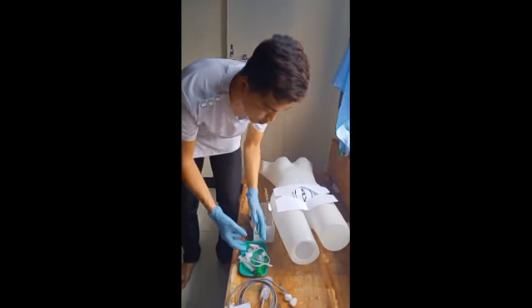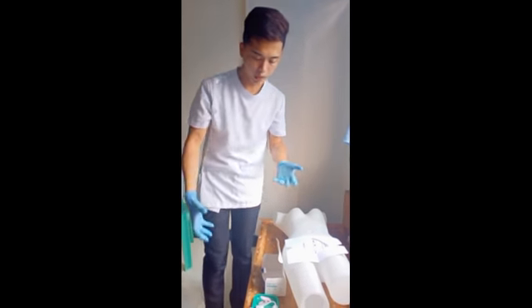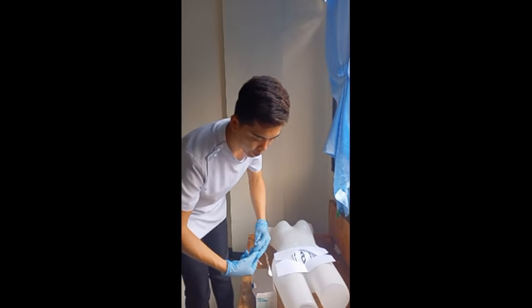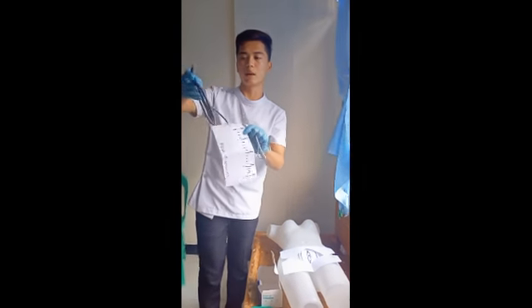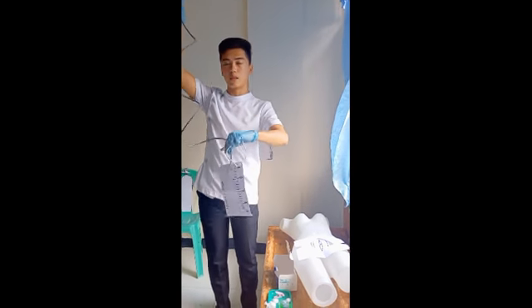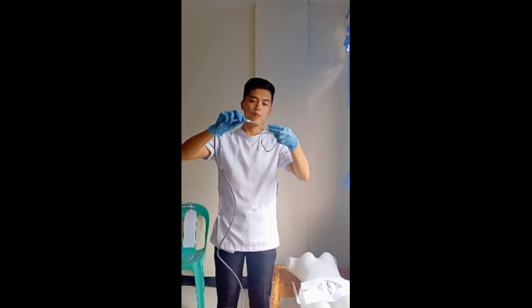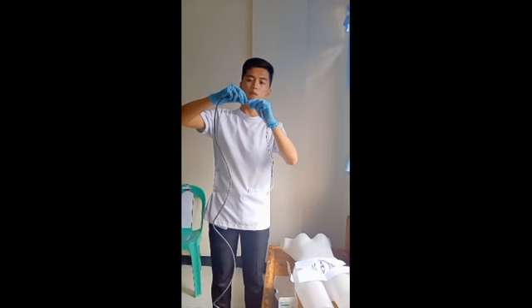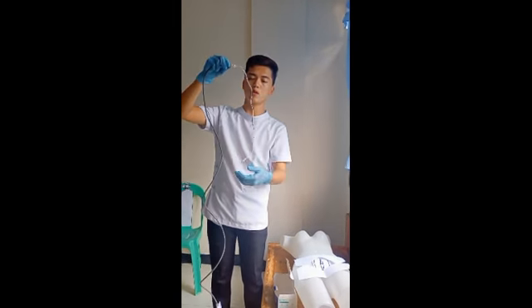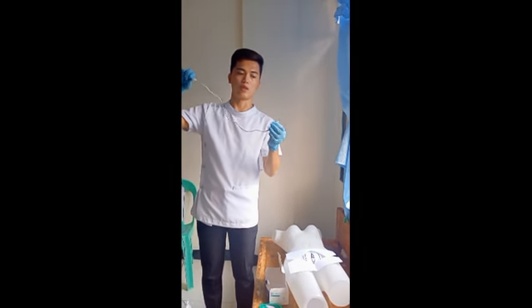So the next is I'm going to place the urinary bag. Okay, this is the urinary bag. You need this procedure because we are getting the urine from the bladder of the patient.